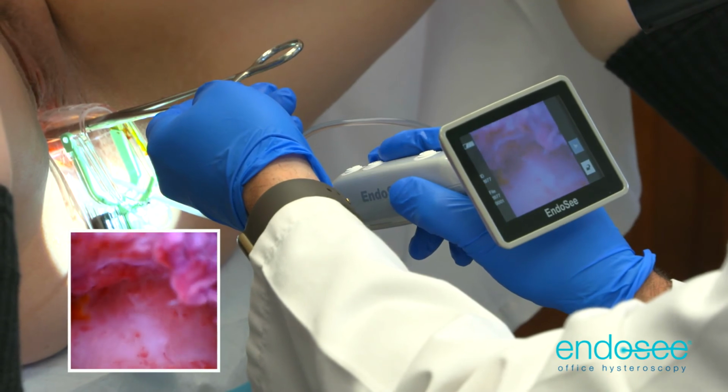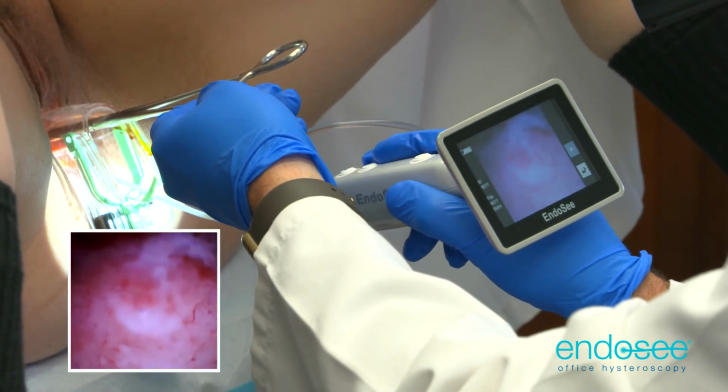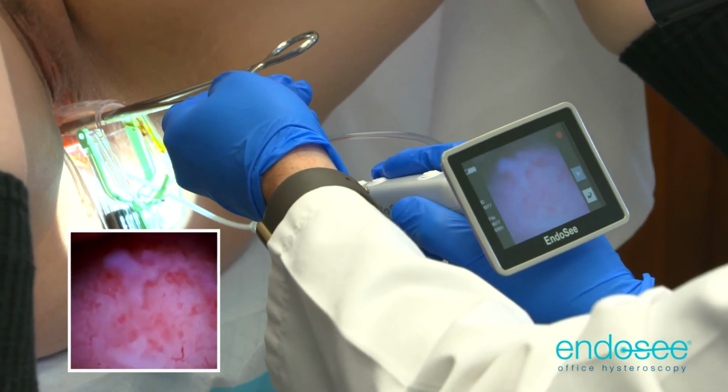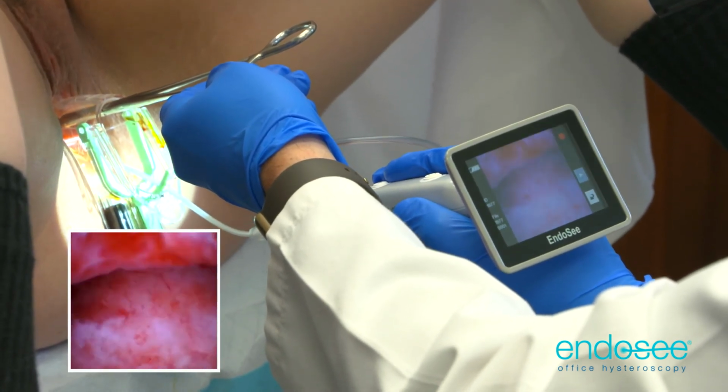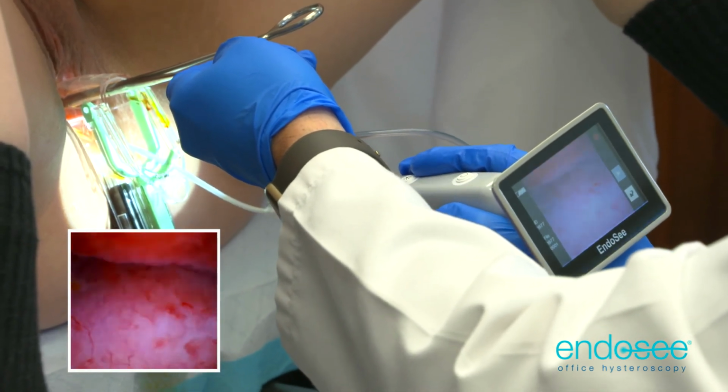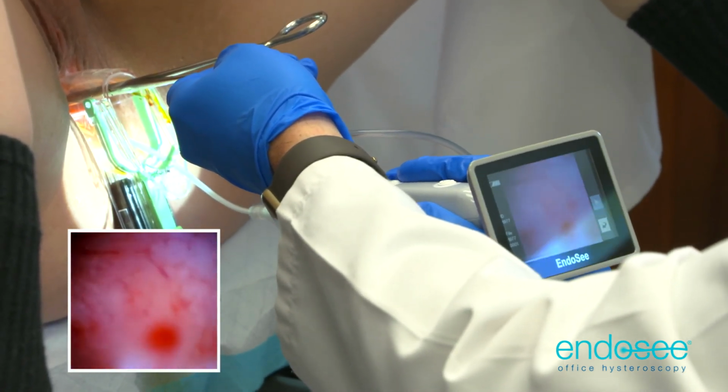This procedure seldom takes longer than probably 3 to 5 minutes to perform, and the endometrial biopsy takes an extra 30 to 40 seconds afterwards. So it really doesn't add that much to the patient's overall visit, and we get two things done at the same time. We get a visualization of the cavity and a biopsy.